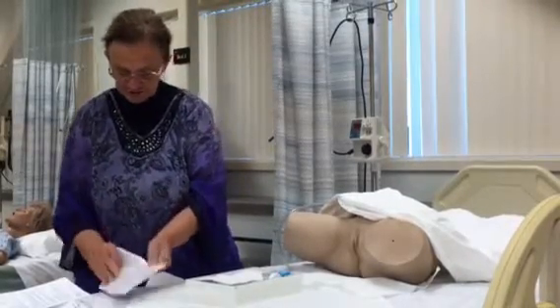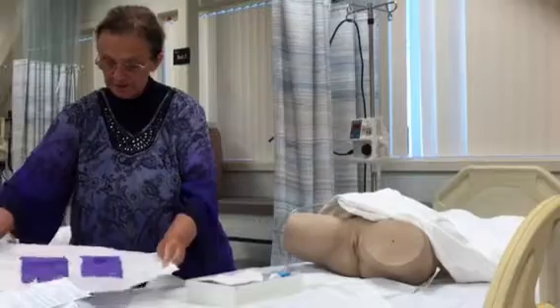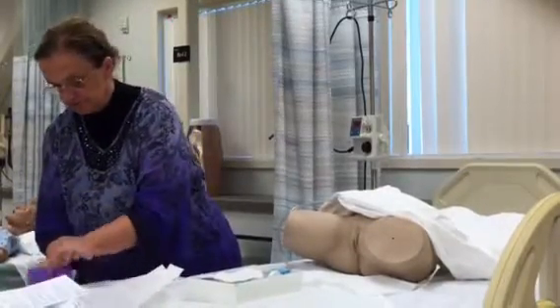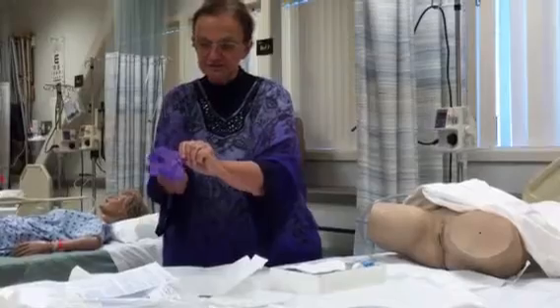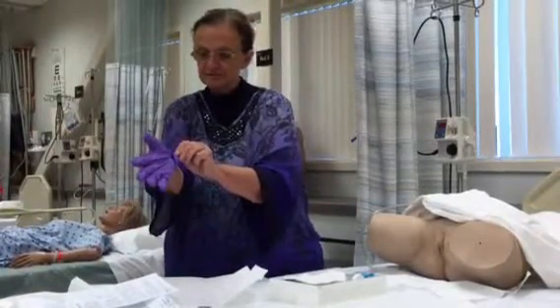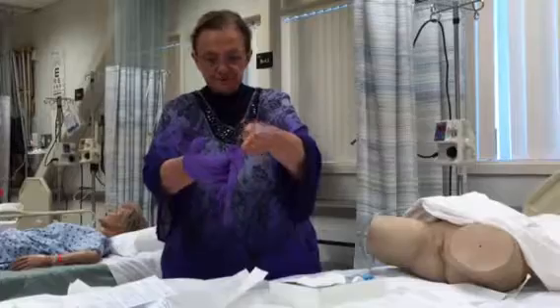And I should mention I did wash my hands first, and I did explain the procedure to the patient, all right? So I open up the gloves, and then your first glove goes like this. You can touch the inside. Inside is considered contaminated, as are your hands. And I want you to notice I'm going to hold my gloves up high so that I don't accidentally get fingers hitting on something and contaminating it.